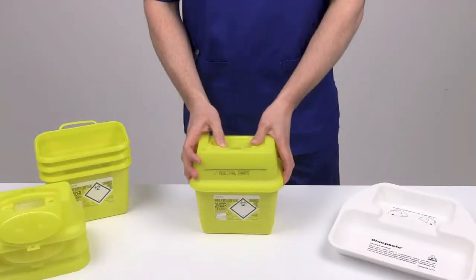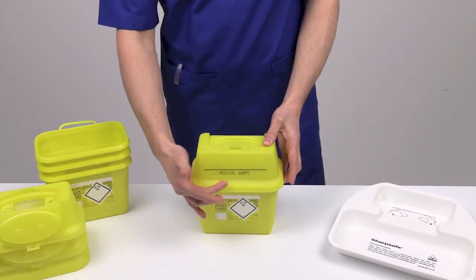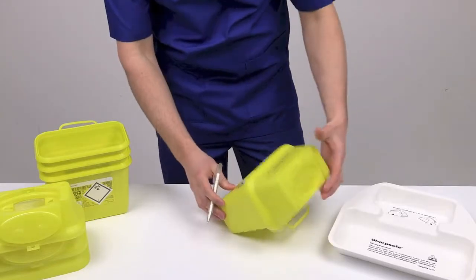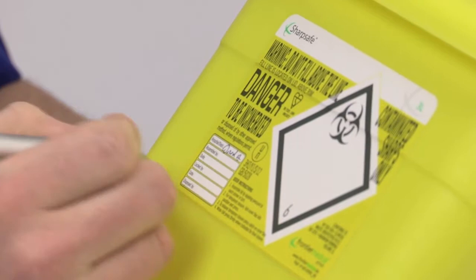Before use, familiarise yourself with the position of the fill line, label, and the waste type printed on the rim. Fill in the details on the label: your hospital or site, department or ward, your name, and the date you assembled the container.